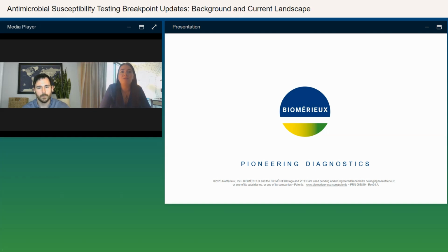A lot of folks are really struggling with some of the changes that have happened, where at one point organisms were cleared in a package insert as clinically significant gram-negative bacilli, as kind of this big group. And so anything that folks thought was clinically significant gram-negative bacilli probably fell in there. And now things are listed very differently in these package inserts. They are specifically listed as genus and species organisms that were cleared specifically for that use. And so conversations around what your options are definitely more of a deeper dive off-label conversation.